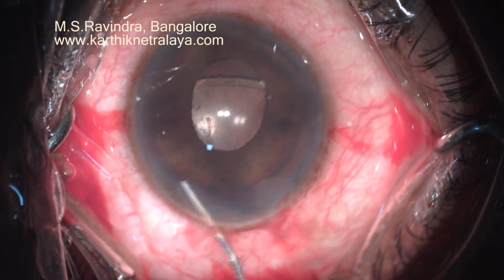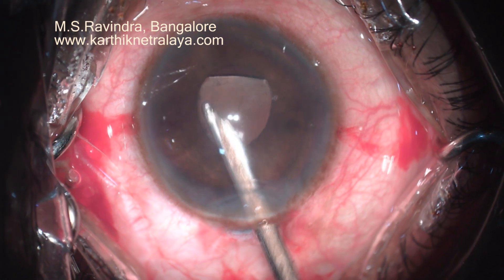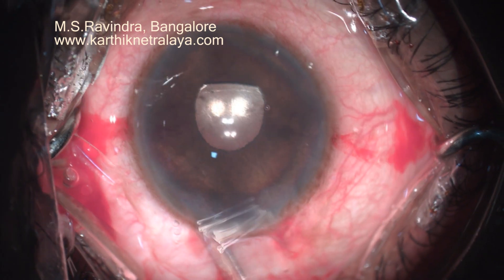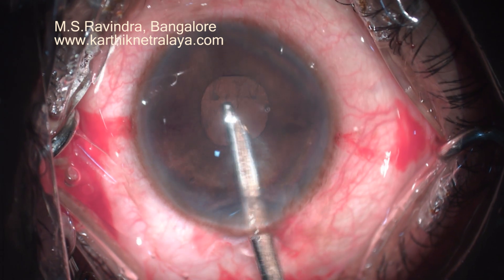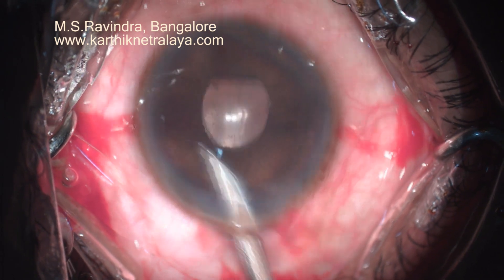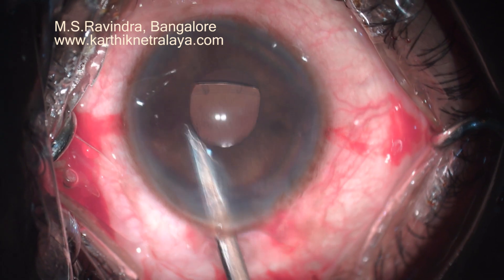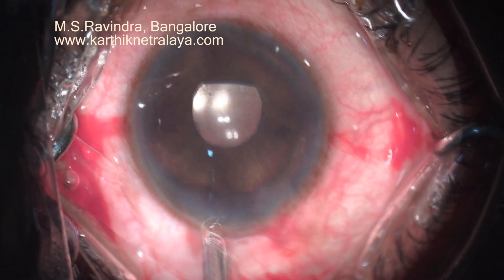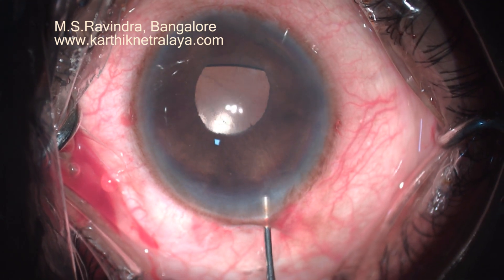The patient has done extremely well post-operatively and we need to monitor the pressures during the post-operative follow-up. This novel surgery appears to be safe, simple, least invasive, and does not involve operating on the sclera, ciliary body, vitreous base and vitreous, and has given excellent results. Thank you.